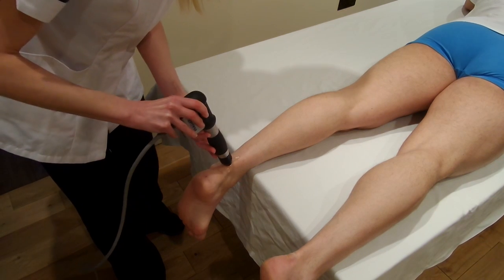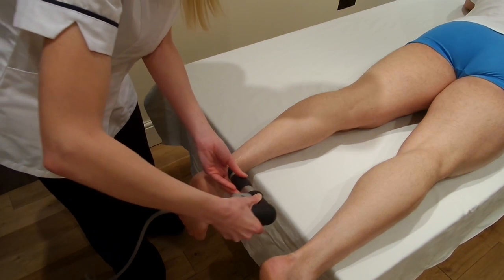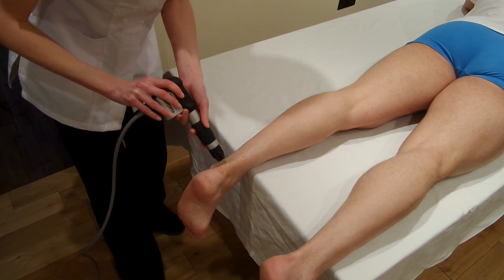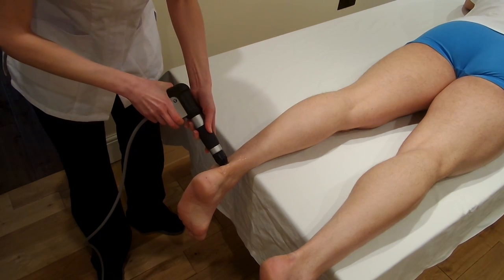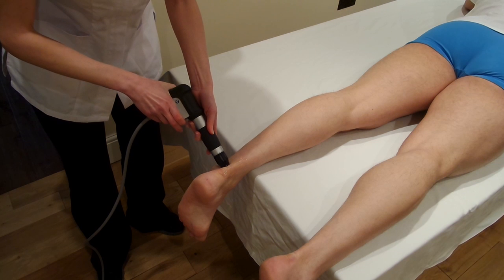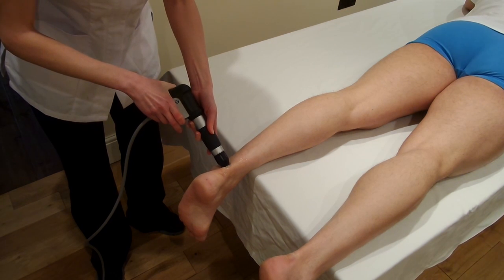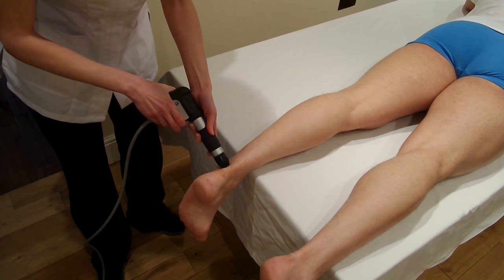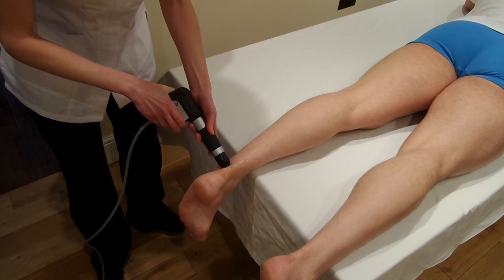Just spread out the gel first of all, and then we're going to start the treatment in spots of 200 shocks per area. The Achilles tendonitis area is often too big to do in one go, so we apply the shockwave in spots. In this case we're going for 2,000 shocks, so it will be 10 spots around the Achilles tendon at 200 shocks per spot.